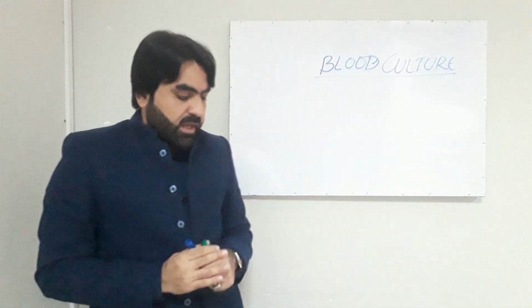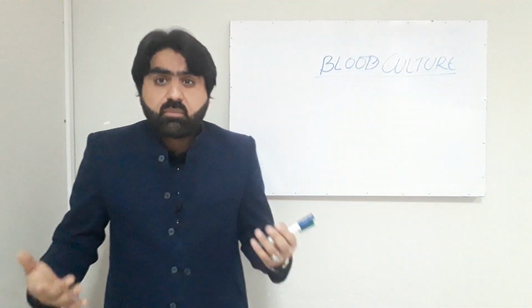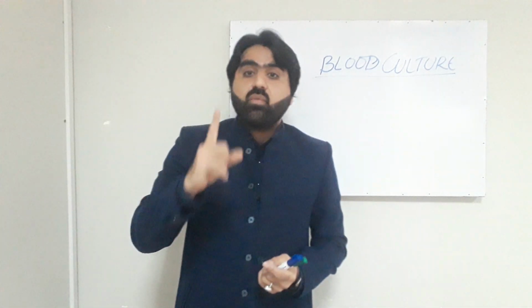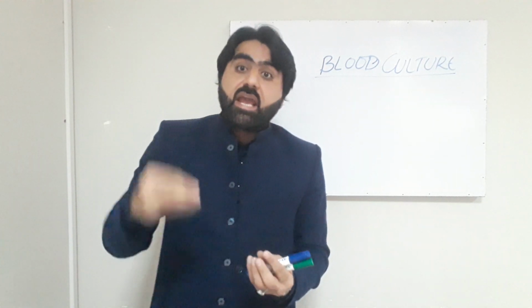Now the other question is, which type of media should be used for the inoculation of blood? The first and important thing you must know is that we always inoculate blood in liquid media, in broth inside the bottle. Why?